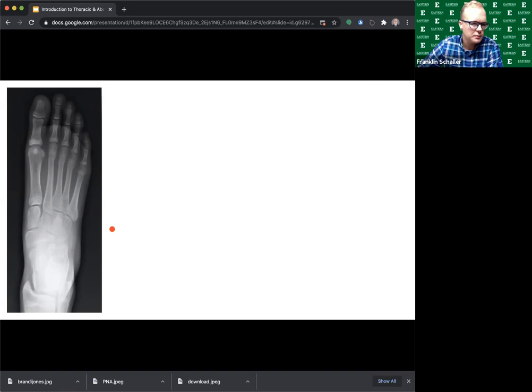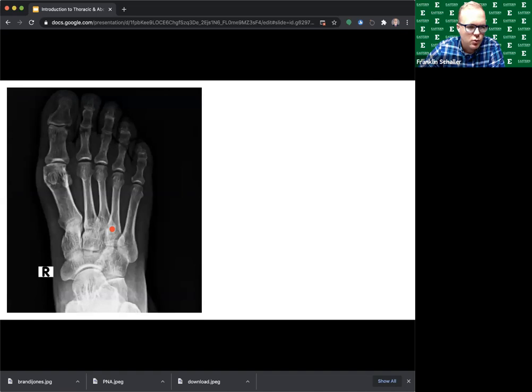All right, a 61-year-old female was letting the dog out to use the bathroom, stubbed her pinky toe on the doorway, and is now having right pinky toe pain. On exam, that pinky toe, there's some tenderness to palpation. So you get an x-ray to evaluate for fracture. Any abnormalities there that you guys can pick up?